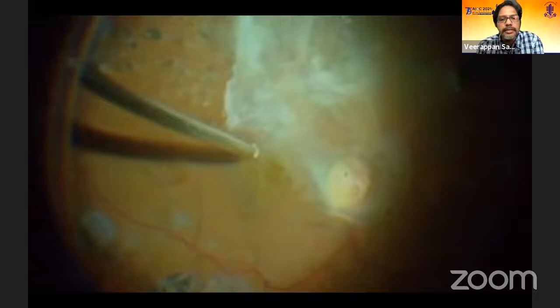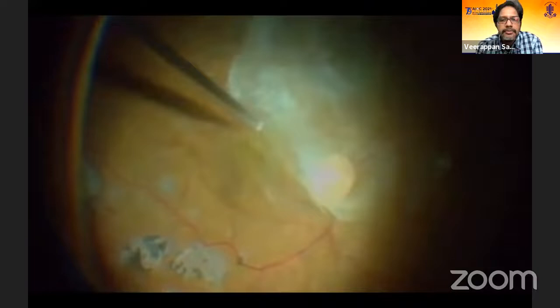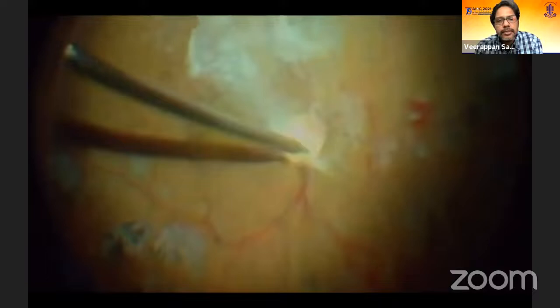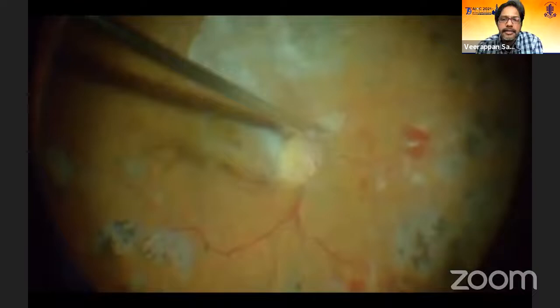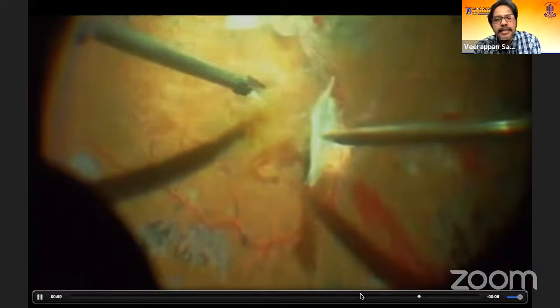Here I'm showing a case where I realized there was a very transparent second membrane running from the inferior arcade to the superior arcade — a one-eyed patient with a superior tractional retinal detachment and vitreomacular traction as well. Unless you identify this, the risk of creating iatrogenic breaks is quite high. In this particular patient, we were able to avoid a tamponade because we avoided an iatrogenic break. Here I'm shifting to a bimanual technique to address the superior membrane, which is very taut. As I remove it, you can see the two membranes: what I'm holding is the PVD, and the transparent floating membrane beneath it is the second membrane. Always identify it correctly — it is critical to making your surgery easier and less complicated.